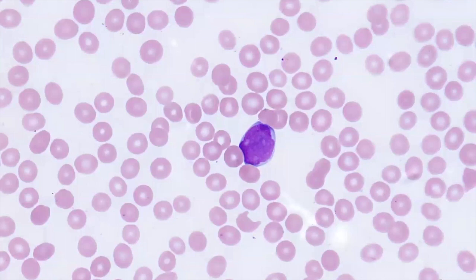When starting out, it may be difficult to identify blasts due to the paucity of blasts seen in the peripheral blood smear and even in the bone marrow, especially with hemodilute samples. A good way to identify a blast or an immature cell is to see these prominent nucleoli. In addition to nucleoli, you really do want to see a smooth chromatin pattern, and without a physical cell in front of you, it's difficult to describe the chromatin as smooth and to understand that concept.